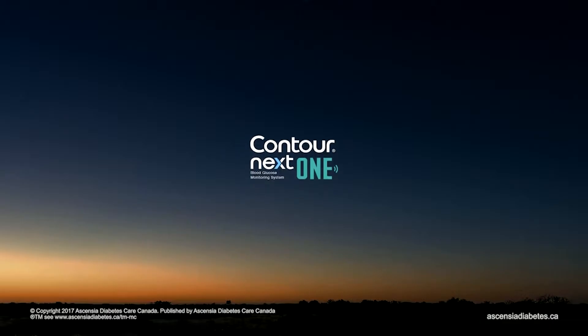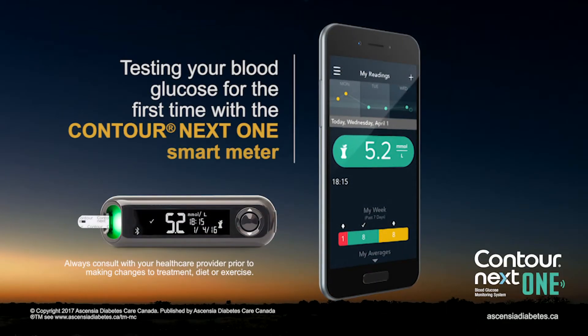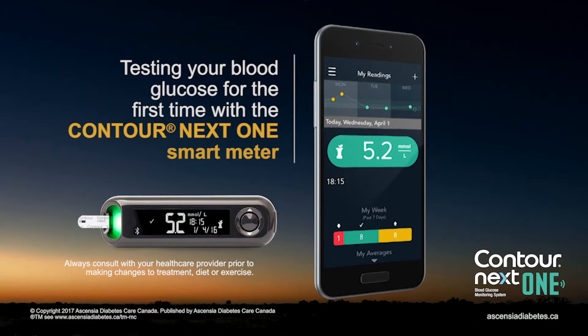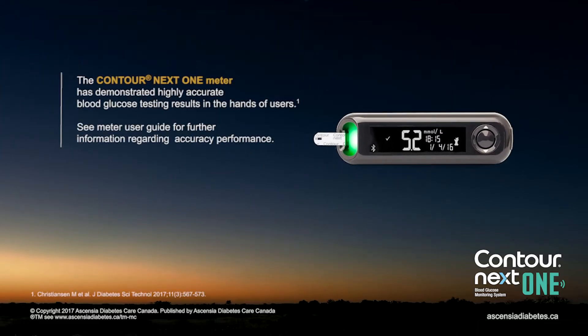Contour Next One Blood Glucose Monitoring System. This video will show you how to test your blood glucose for the first time with the Contour Next One Smart Meter. The Contour Next One Meter has been shown to provide highly accurate blood glucose results.